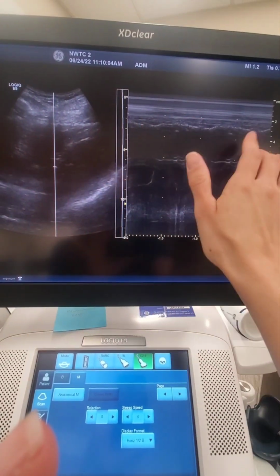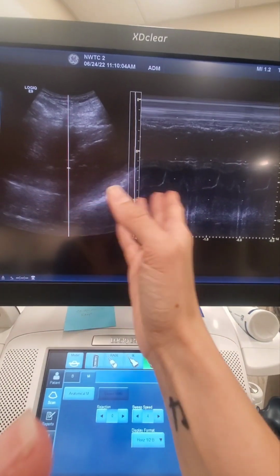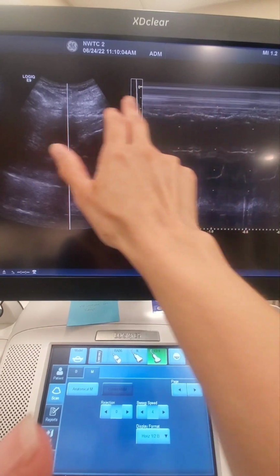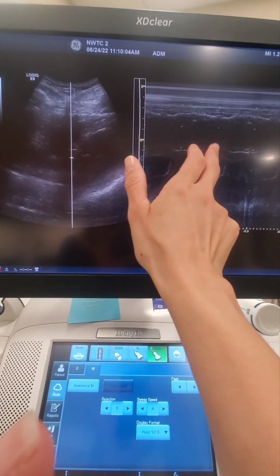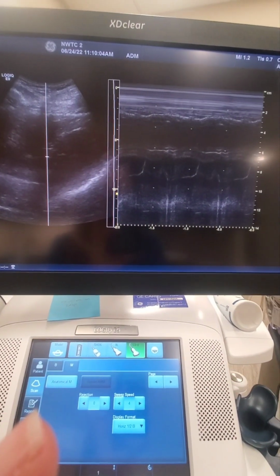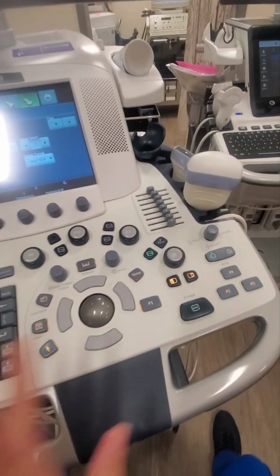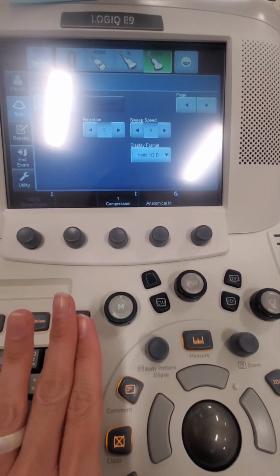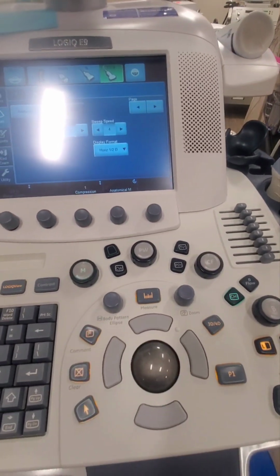You see how it's just the echoes across time as they move, or as you can see, not really any movement up here or right here. We just have the bright echoes across time and the dark or no echoes across there. So that's your B mode, your color flow, your pulse wave, your M mode. Those are your modalities that you're scanning in, okay?